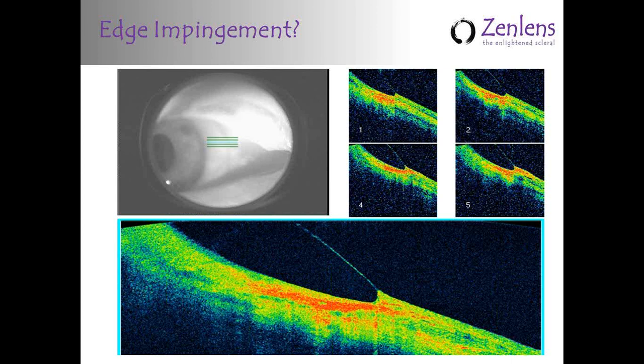If the impingement is obvious, if you see blanching of the vessels during the diagnostic fitting, if the blanching is occurring within 20, 30 minutes, that tells you you're going to have to do more than just a single one-step adjustment. Typically 2 or 3 steps would be appropriate.